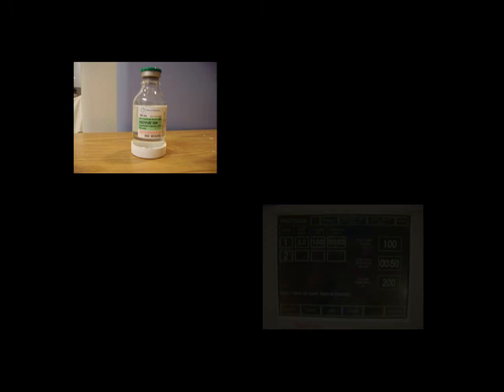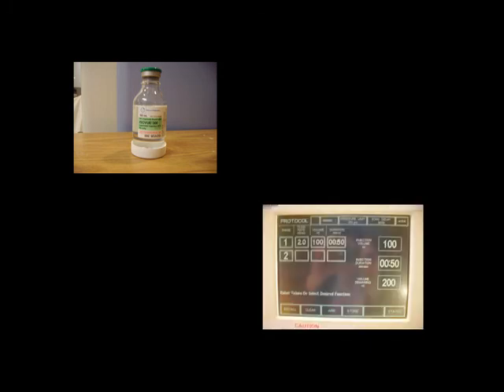Now a lot of times you will do contrast with either the chest or the abdomen and pelvis. And now with the 64 slice machines, most places have gone to just using 100. Some places are still using the 300 Isovue. Some places are using 350 now. And this is a picture of your injector. Again, you'll be injecting at 2.0 or 2.3, somewhere around there. And it'll take about 50 seconds for your contrast to go in.